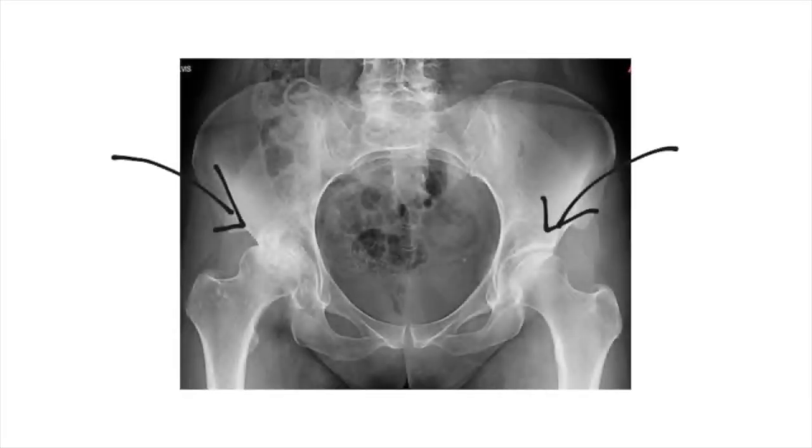In this particular x-ray, one hip looks great and the other does not. Can you tell which is the good and which is the bad?